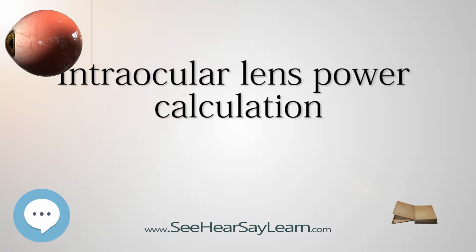In highly myopic or staphylomatous eyes, this can be particularly advantageous since it can sometimes be difficult to measure the true axial length through the visual axis with an ultrasound probe. PCI is also superior to ultrasound in the measurement of pseudophakic and silicone oil-filled eyes. For optical biometry, it is not as critical how the media change because the correction factor that must be applied is much smaller than in ultrasound biometry.